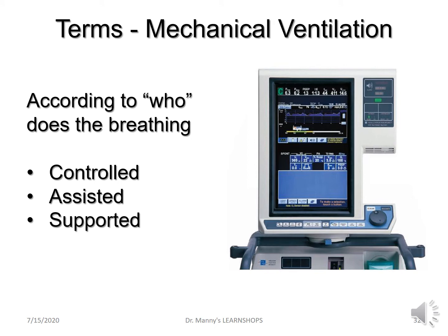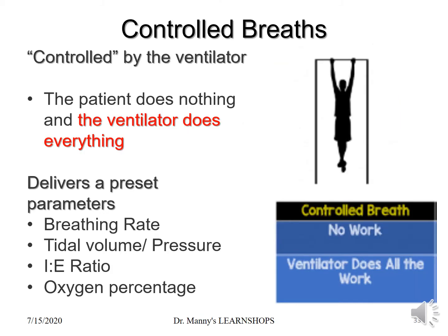So what are some of the terms that we might commonly use which are associated with mechanical ventilation? Well, the terms are according to who, what does the actual breathing. So the common terms are controlled, assisted and supported. Control, assist, support.